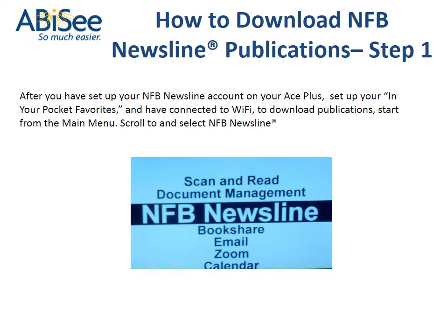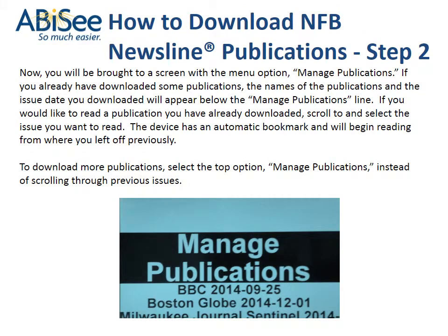Step 1. After you have set up your NFB Newsline account on your Ace Plus, set up your In Your Pocket favorites, and have connected to Wi-Fi to download publications. Start from the main menu. Scroll to and select NFB Newsline. How to download NFB Newsline publications.